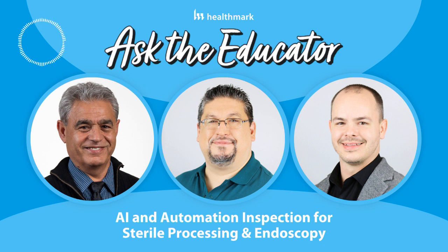So when the report goes to them, they can look at the report and recall the video to see what's wrong with this endoscope, and then they can send it to the manufacturer or third party, whoever does the repair, and then it comes back repaired. So really that is the power of artificial intelligence. Some people call it, in this case, augmented intelligence, to help the facilities, the hospital, make their job easier.